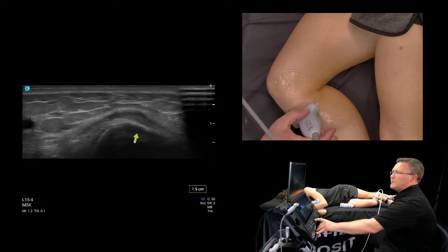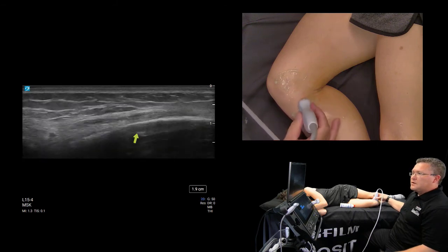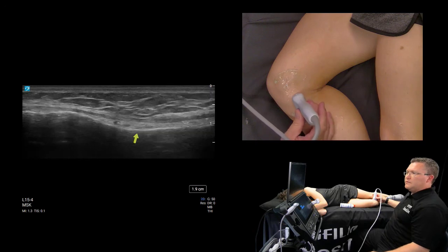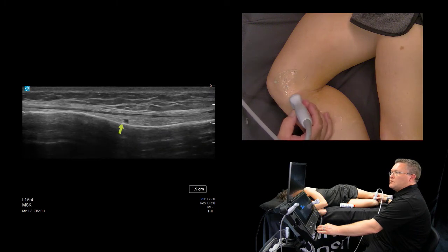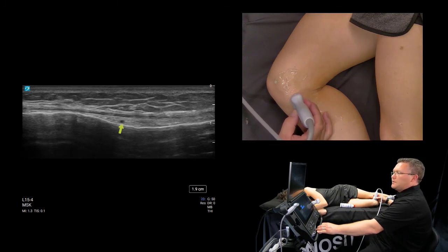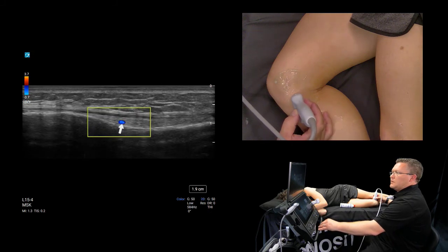Now, earlier I mentioned neurovascular structures on the lateral side of the knee, the inferior geniculate area. Here, just because we're in the neighborhood, we might as well point it out. Here's the inferior medial geniculate artery right there. I know there are some pretty neat neurovascular procedures being done under ultrasound guidance, and it's very useful to be able to point out these vessels because they're roadmaps to the nerves, but also to point out what not to hit when you're doing procedures.